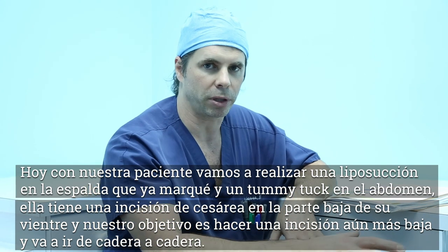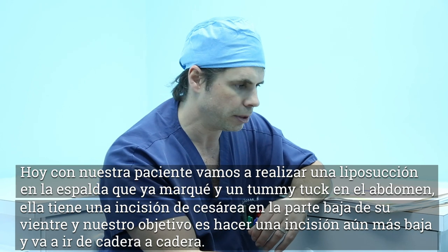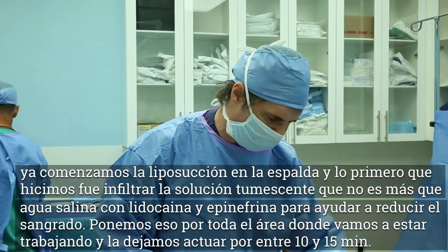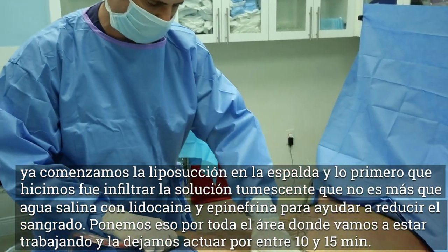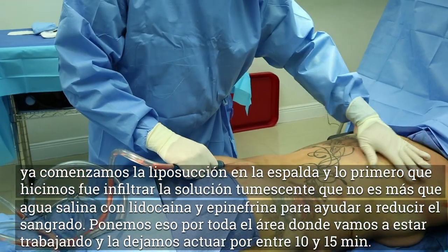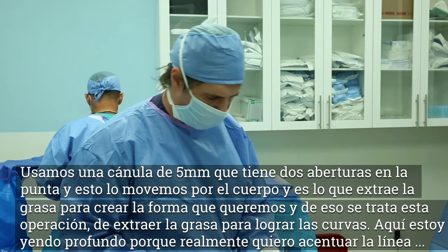Today with our patient we're going to be doing the tummy tuck with liposuction on the back. I already marked the liposuction on the back and I've already marked her tummy tuck. She has a very low C-section from her child — our goal with the tummy tuck is to make an incision lower than the C-section, going from hip to hip. We've already started the liposuction on the back. The first thing we do is infiltrate the tumescent solution, which is a saline solution with a little lidocaine and epinephrine to help with bleeding. We put that throughout the entire area and allow it to sit for about 10 to 15 minutes so the blood loss during the operation is very small.